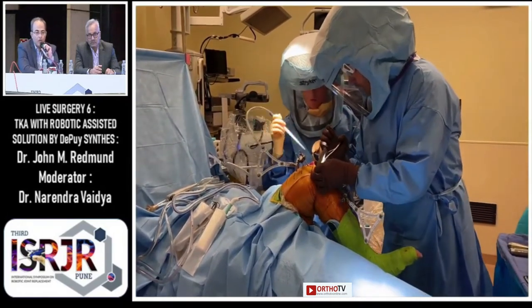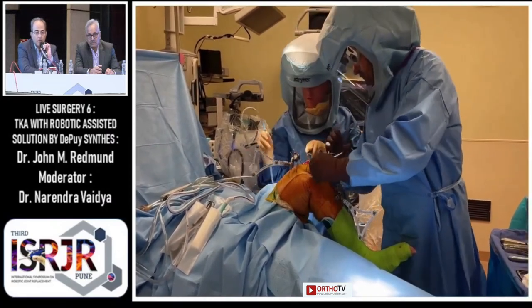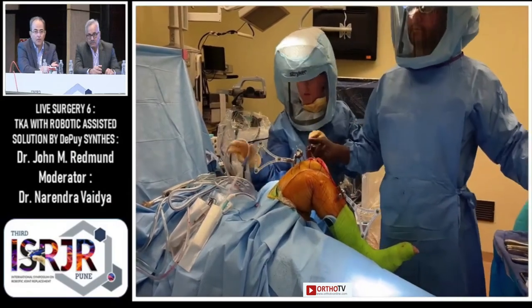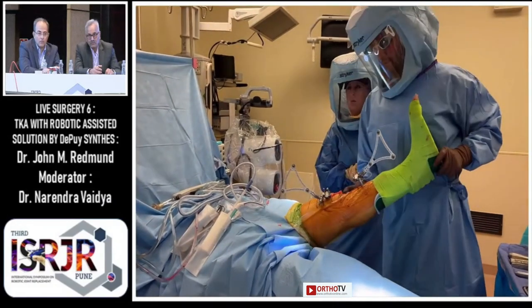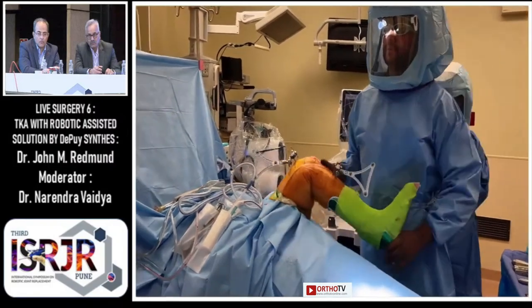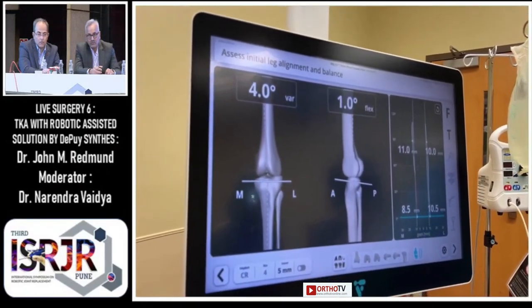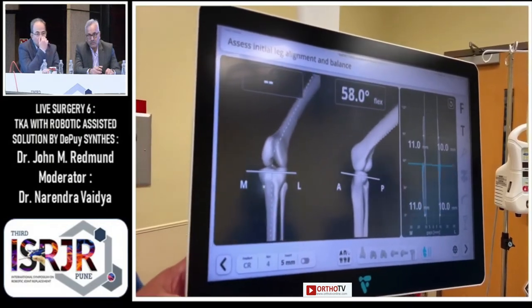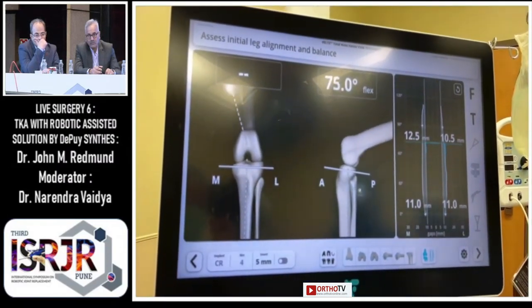I use patient-specific alignment. People who do kinematic alignment can also use this robot very easily because you're mapping cartilage and bone and can understand the anatomy quite well. The robot is tailored to whatever alignment philosophy you like, since you get topographic data on the femur. This patient is in a little bit of varus, so I'll correct the knee into a little bit of varus. I've now removed the osteophytes and am collecting soft tissue data on the medial and lateral side of the knee.